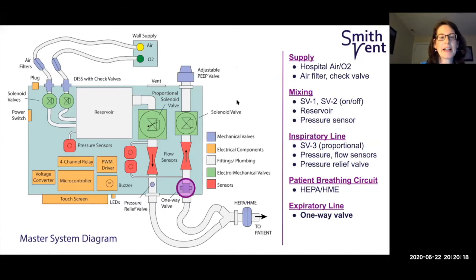And it enters the expiratory line, where it goes through a one-way valve to keep the patient from accidentally inhaling their recently expired breath. The expiratory line also has a pressure sensor and a flow sensor to collect data for system controls. The solenoid valve on the expiratory line, SV4, is also an on-off valve, like the first two, except that its resting state is normally open rather than normally closed. This means that in case of mechanical failure, the patient will always be able to exhale. It's worth noting here that SV3 and SV4 alternate so that inspiration and expiration can't happen at the same time.